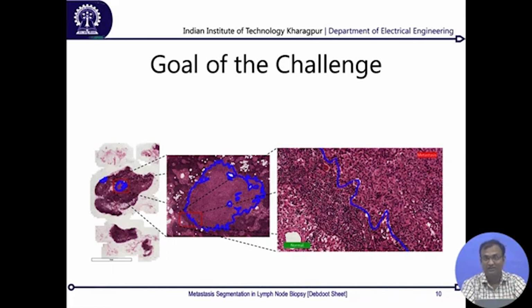So this is where the big data deluge comes in for you. You can do your basic math over here as to what the pixel size and operator size are, what the total throughput will be, and what total compute power you would require in order to solve this problem. That is where this challenge initially started in 2016, and there was a lot of skepticism within the community as to how well they would be able to tackle this problem given the scale of compute associated with it.